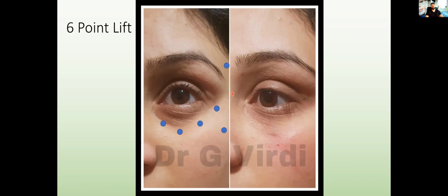So this is what we can call a non-surgical lateral canthoplasty. And my final injection will be in the malar region here, in the lateral zygoma, deep onto periosteum. You can inject something a little bit thicker here and in slightly more volume in order to provide structure and support.